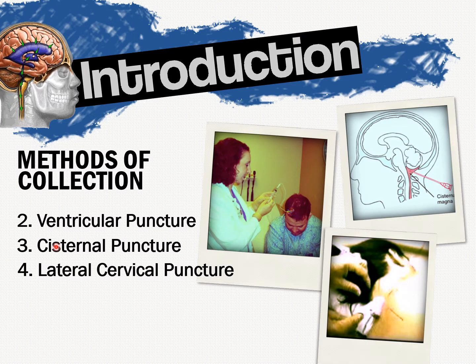The next one is called ventricular puncture, where the CSF is collected directly from the ventricles of the brain through puncturing the fontanelles in special circumstances. So this one is an example. The third one is cisternal puncture. This is often preferred for those with serious spinal deformities or extreme age, which make lumbar puncture difficult. So here. This requires special expertise and should be performed by a neurologist or a neurosurgeon. The last one is called lateral cervical puncture, which is collection through the neck.